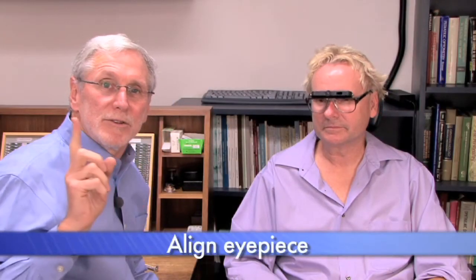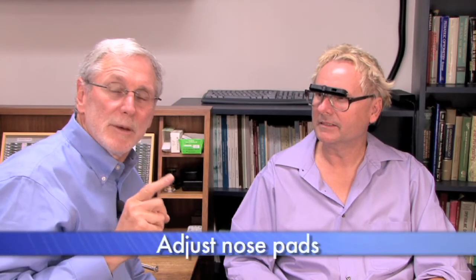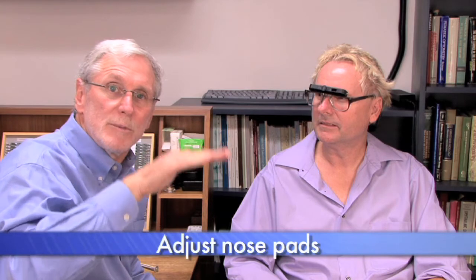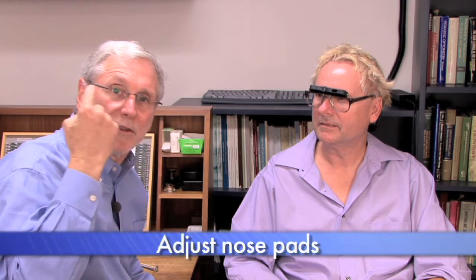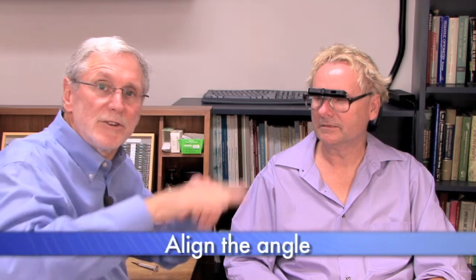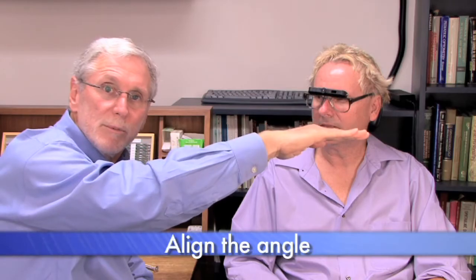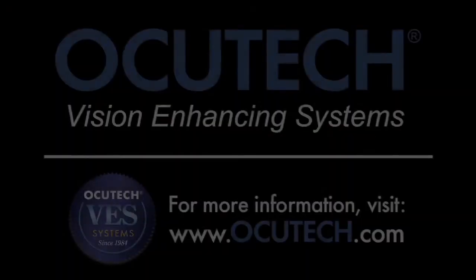Step one: line the telescope right to left so that the eyepiece lines up with the pupil. Step two: adjust the bridge to get the frame as low as you possibly can so that the top of the frame lines up with the top of the pupil. And lastly, change the angle of the telescope so that when the patient drops their head down they're looking directly through the eyepiece.